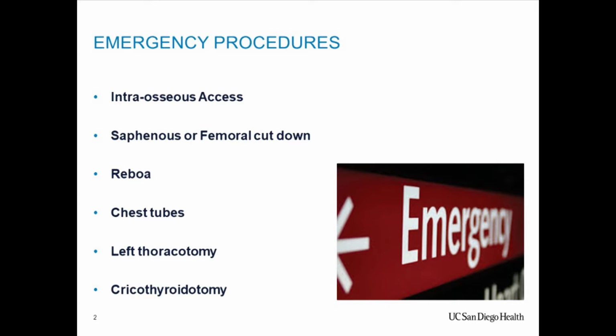About the IOs, is there any chance of getting radiology to allow us to do scans with contrast with IOs? Because that's our issue: we put an IO in, we want to do a CAT scan, and they say that's not in our protocol, we won't do it. So then you have to bring them back up, and try to get a peripheral IV, or put a central line in to bring down a CAT scan.